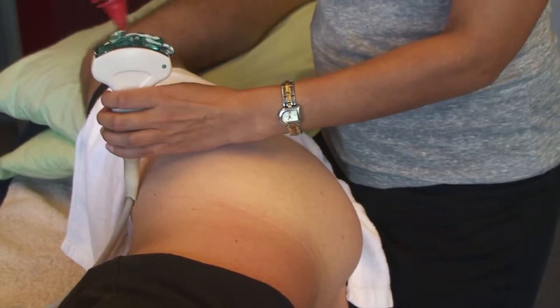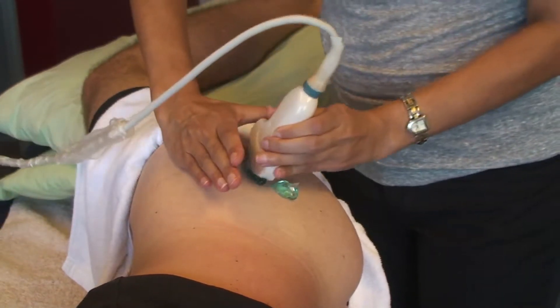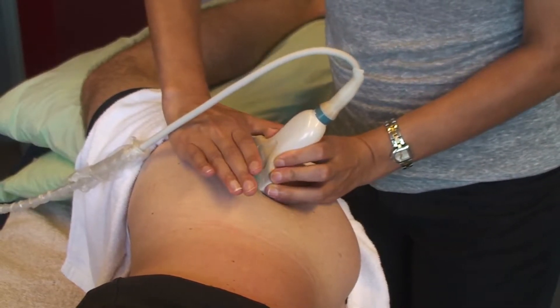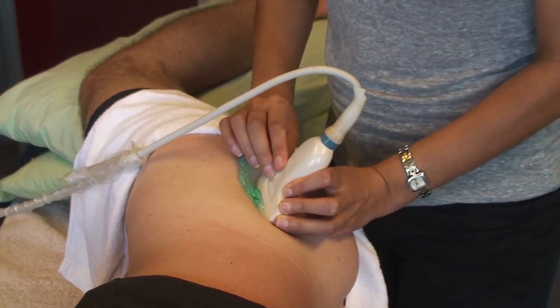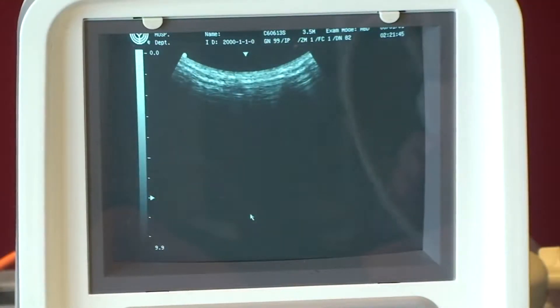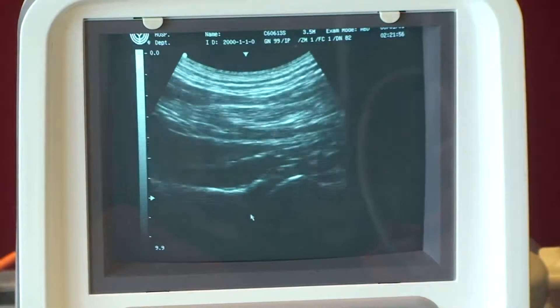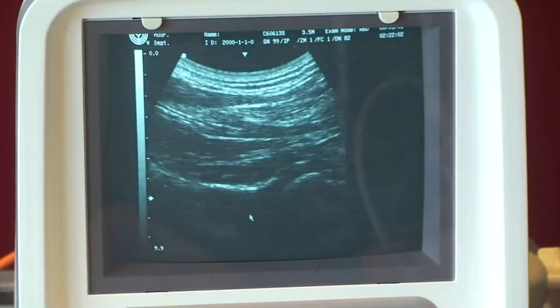We want lots of gel. I'm going to place the transducer head and then look at the settings on the ultrasound machine. I'll apply some gel to the transducer head, place my hand on the greater trochanter, then position the transducer head just where my fingers would lie. And here I get a nice image of the gluteus minimus.